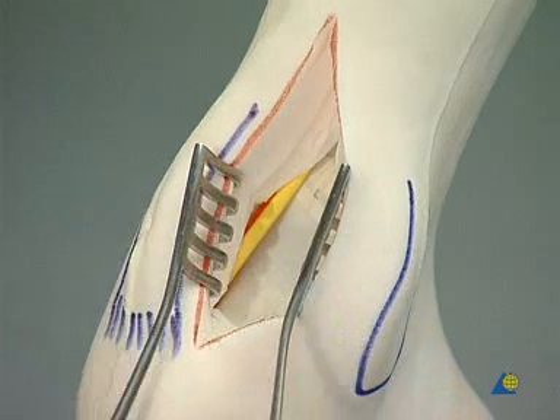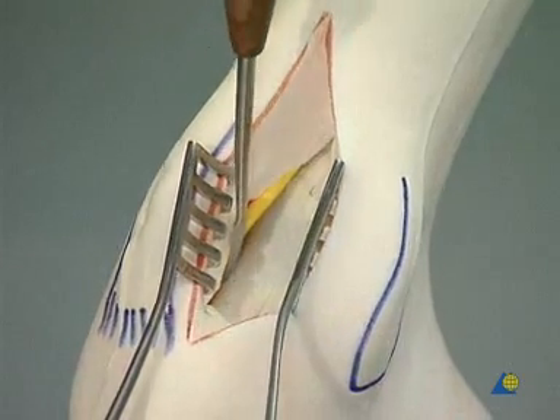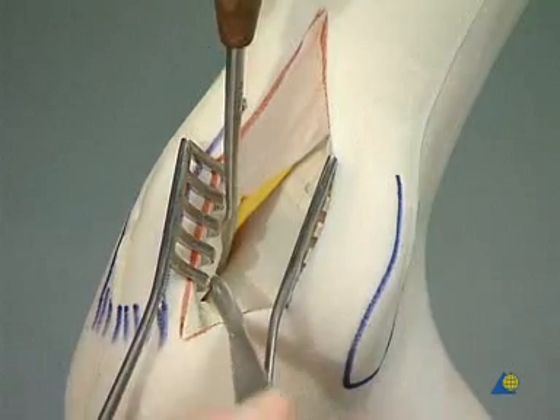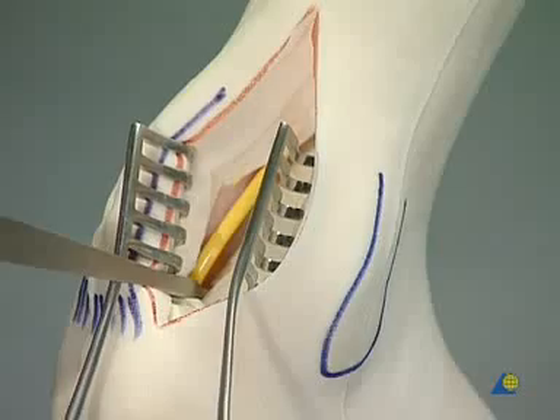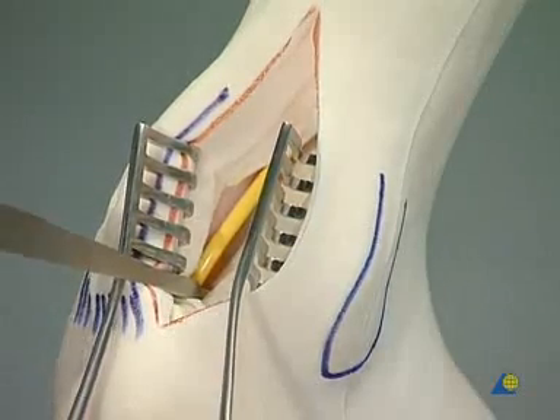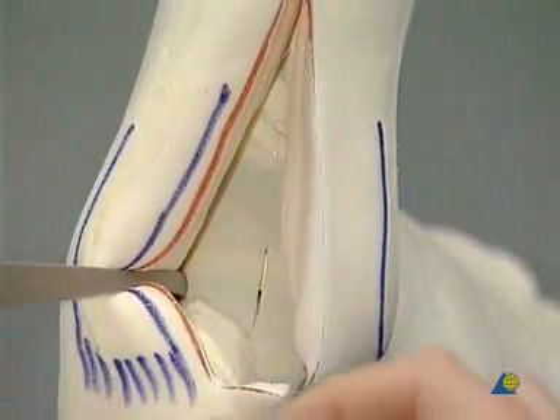The periosteal elevator is used gently to lift away the neurovascular bundle from the bony surface so that a small bone lever can be placed on the medial aspect of the subtalar joint. Another bone lever is placed beneath the lateral malleolus.